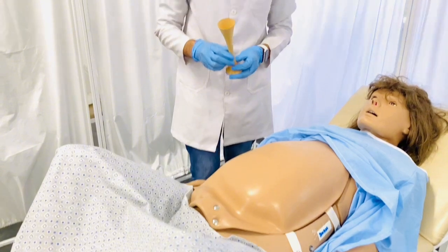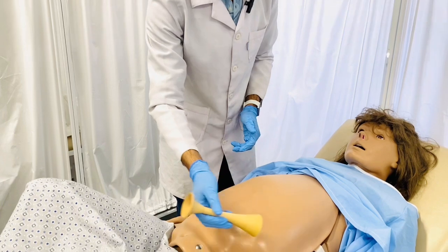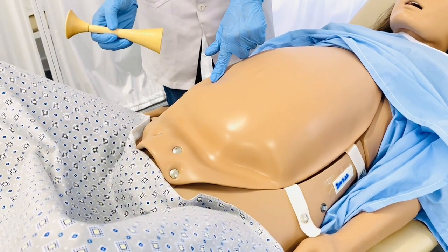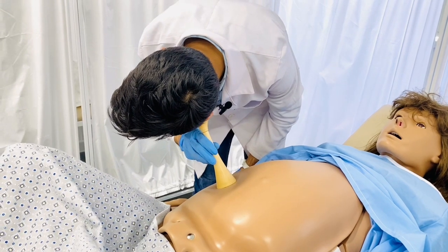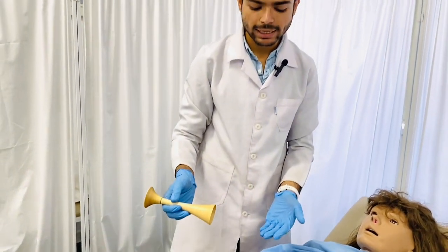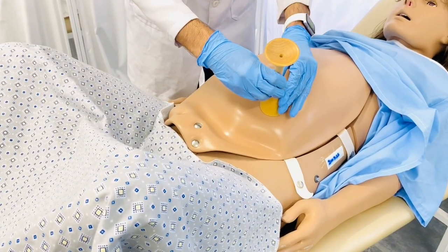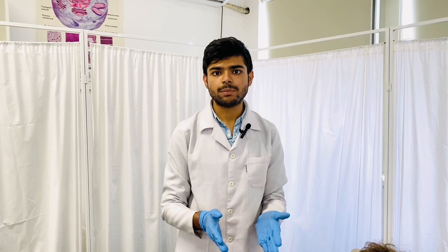For auscultation of the fetal heart sounds, we will use a Pinnard stethoscope or fetoscope. Now we know the localization of the fetal back, so we will place the stethoscope at that point. For example, if the fetal back is at the right occipito-anterior, we place the stethoscope there and listen. If the localization is left occipito-anterior, we place the stethoscope at that point. We listen to the fetal heart sound for approximately 15 seconds and then multiply by 4 to get the heartbeat rate per minute. This is all about fetal auscultation.